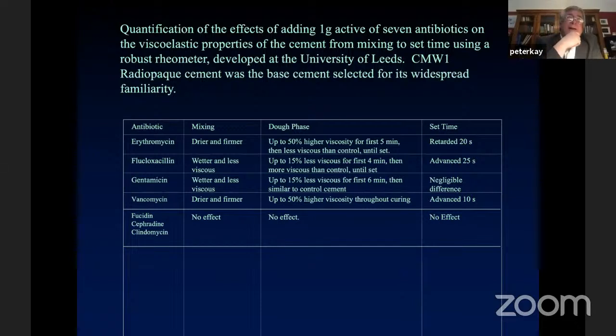The same goes for proprietary cement as well. If you're suddenly deciding to use an off-the-shelf proprietary cement with additional antibiotics, and you've never worked with that particular cement before, you've got to be very careful to understand how it's going to set and how it's going to perform surgically. So I think there is a case to have seen the cement before, or to have some experience of it, or try it in the lab to understand where you are.